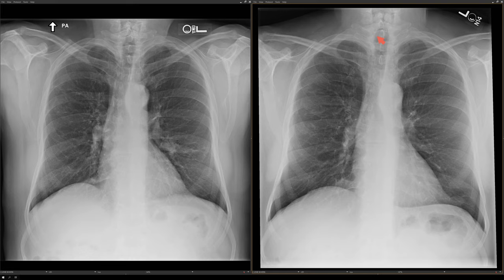Hey everybody, it's Rishi Yagurwal, and in this video I want to show you a classic case. We're going to start out with a chest x-ray in this patient. This is the current chest x-ray, and this is the prior chest x-ray from about two years ago. The history is a 65-year-old man with asthma.